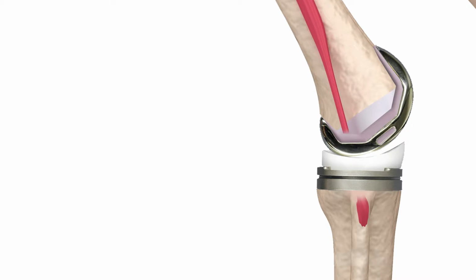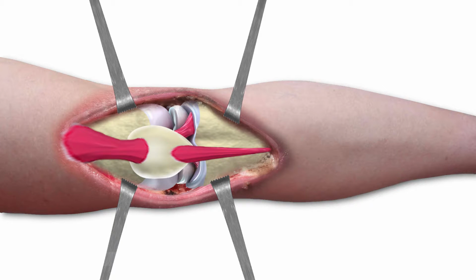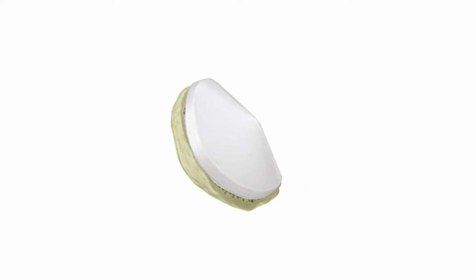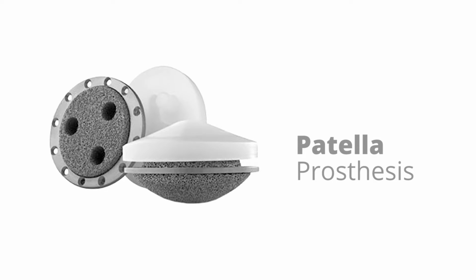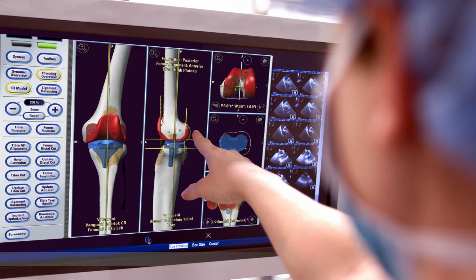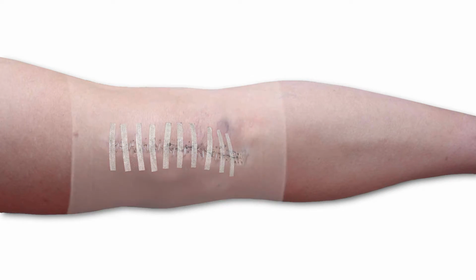and flex your knee. Before restoring the patella, or kneecap, to its natural position, your surgeon may need to flatten the back and fit it with a small plastic prosthesis to create a good fit with your new implant, or even replace it entirely with a prosthetic button. Next, your surgeon will test your knee to ensure the implant is working and the alignment, sizing and positioning are correct. To complete the procedure, your surgeon will close the incision with stitches or staples and bandage.